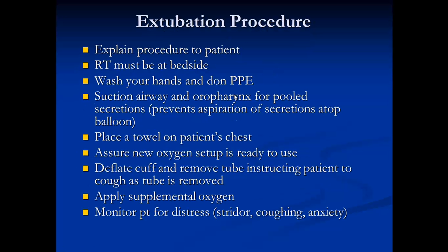Extubation procedures: basically, explain the procedure itself to the patient. The respiratory therapist must be at the bedside. Suction the airway, and this basically is done by the respiratory therapist, but you should know the process itself.